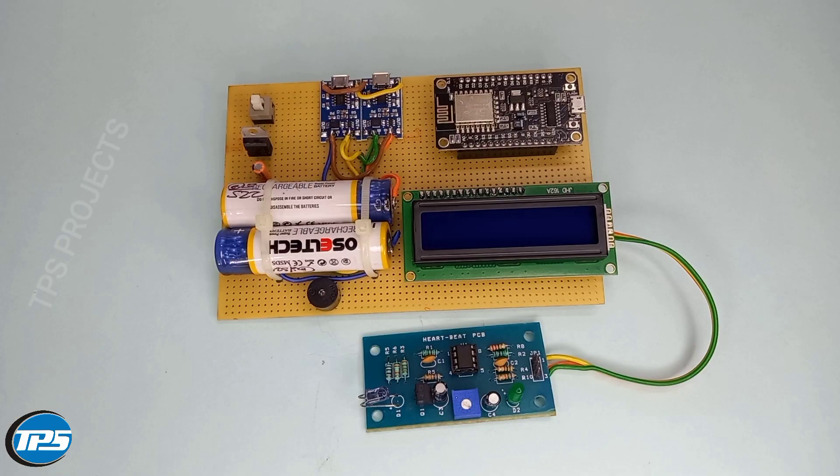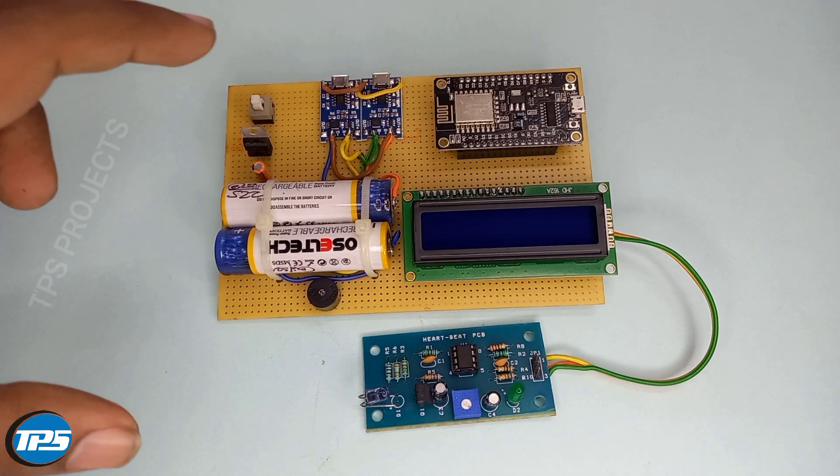Here we introduce a heartbeat monitoring system. Whenever a person's heartbeat goes below or above the normal condition, the microcontroller sends an alert. Now we can see the components required for this project.